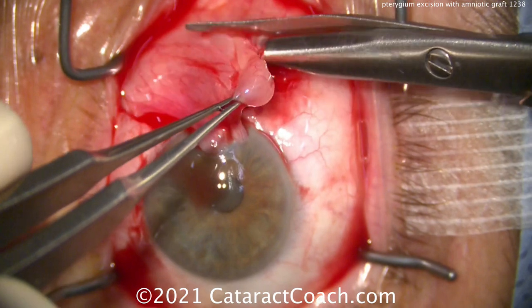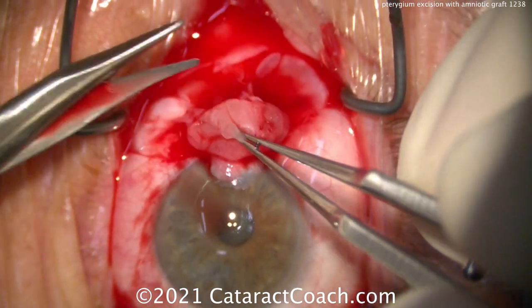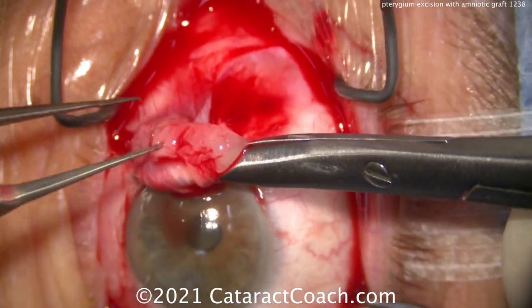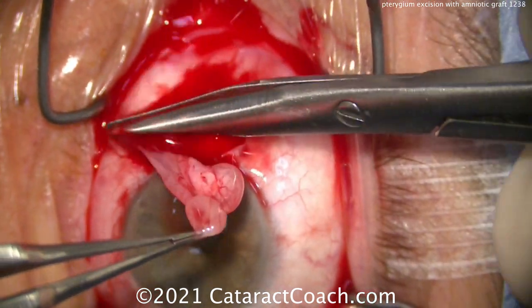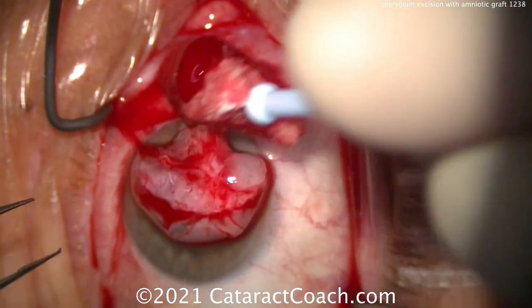Now, very important — keep in mind the spiral of Tillo. What does that mean? Where's the medial rectus muscle? It's about 5.5 millimeters posterior to the limbus there nasally. So you want to be very careful in this area. You're not going to damage that medial rectus — first, do no harm. So there's the whole pterygium. We've kept the medial rectus nicely intact, which is, of course, considered good form.